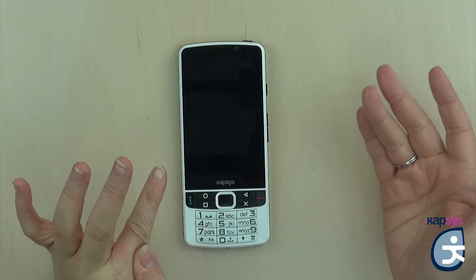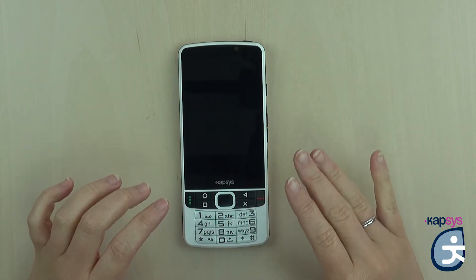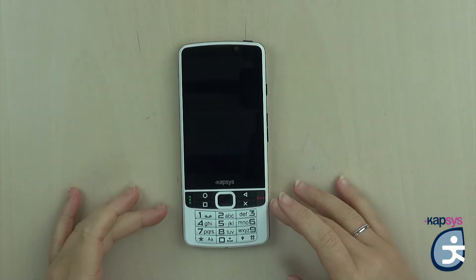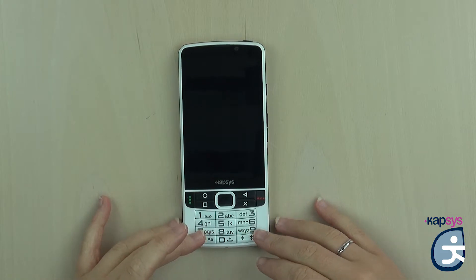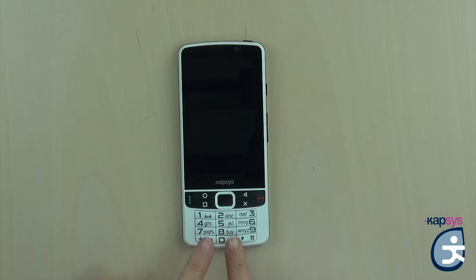Below the touchscreen, you have an alphanumeric keyboard — this is the specificity of the Smart Vision 2. This is an Android 6 smartphone that works with a real physical keyboard. This physical keyboard is composed of two parts. At the bottom, you have an alphanumeric pad with a standard keyboard including the keys 1, 2, 3, 4, 5, 6, 7, 8, 9, star, 0, and the pound key to dial numbers and type text. A little embossed dot is present on the five to position your fingers.